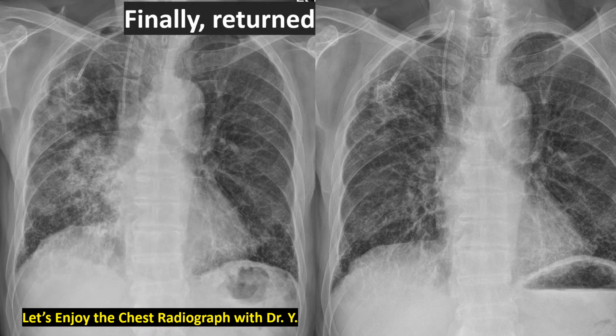Another 6 months have passed. Improved at first, and then later increased. This may include the radiation pneumonitis area. Anyway, or increased after later improvement. Finally, sometime later, small cell lung cancer usually returns to bad condition.